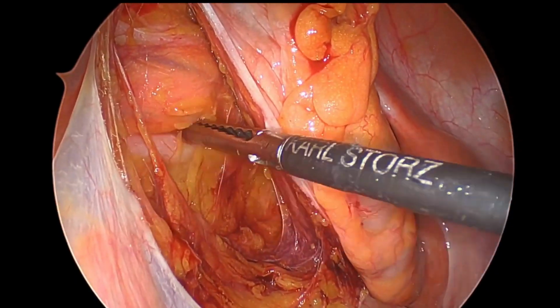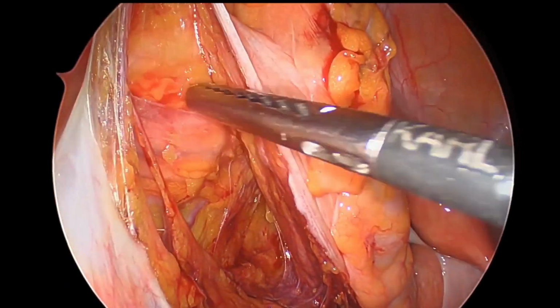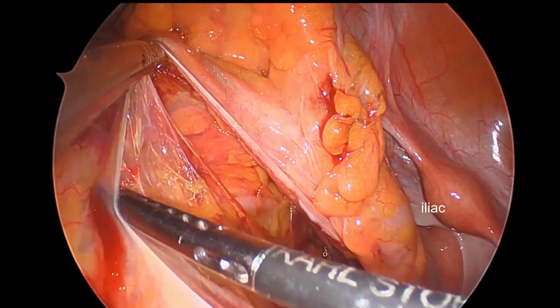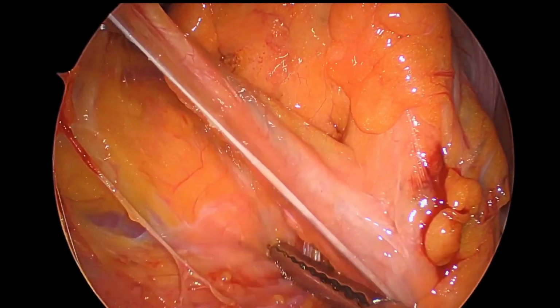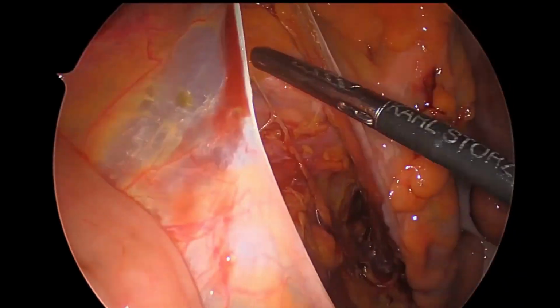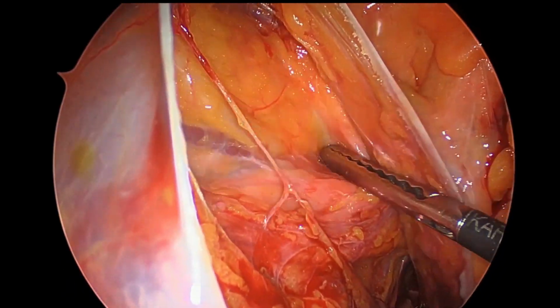And to do that, we see the left common iliac again. To do that and reestablish the plane, we're going to withdraw our left hand and try to open up that window even further. And now you can see that we've found the right plane again. That's the white line of Toldt that we're pushing down. You can see the difference and how that's not exposed. Another good tip for knowing that you've gone too deep is if you see the psoas muscle, you've gone too deep.